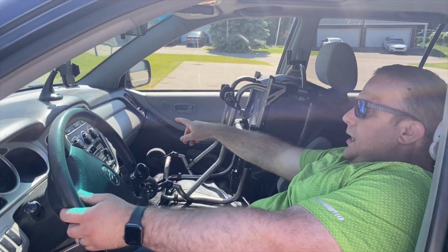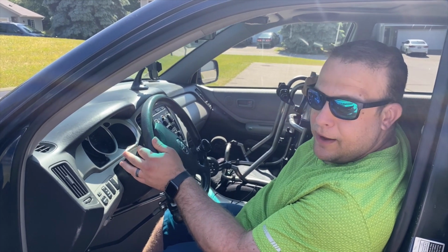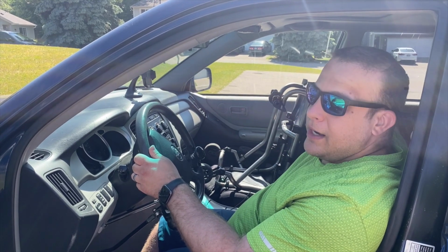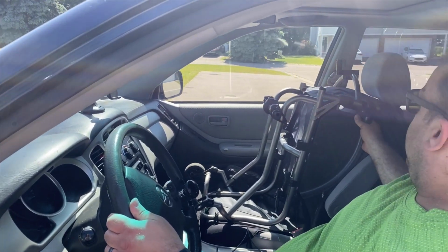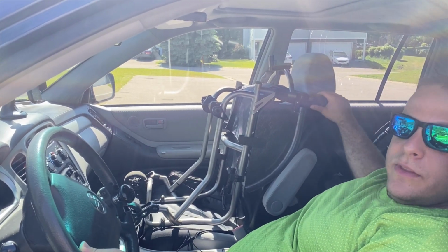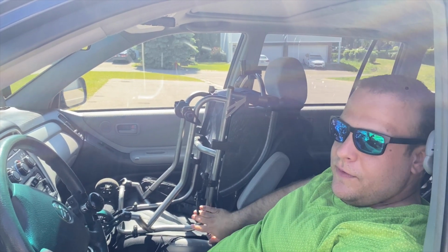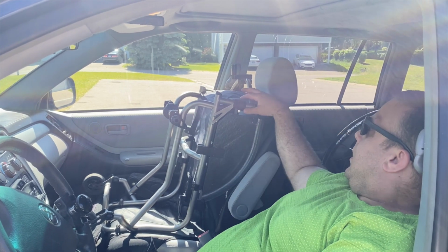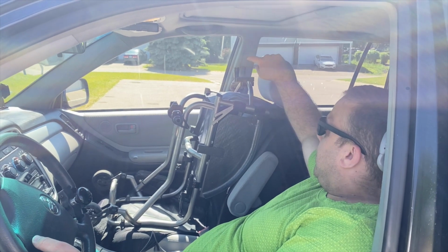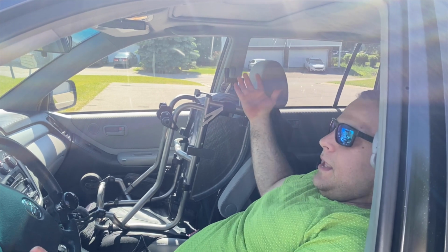And for me, I've learned my lesson, because I've had times where I've had it sitting up here and I slam on the brakes because I have to, and the chair has come forward and dented my dash. So one thing I now try to do is get the backrest of my chair underneath the headrest on the seat so that it kind of hooks. Admittedly, if I slammed on the brakes hard enough, it still would come forward. But one thing I'm thinking about getting is a little bungee strap that I could hook here and then hook there, so that no matter what, it wouldn't flip forward. But that's how I'm in now.